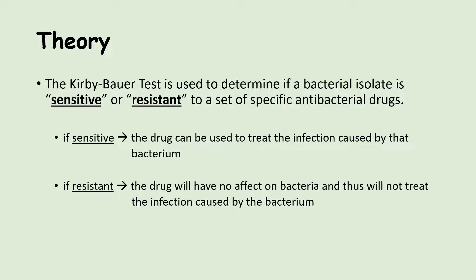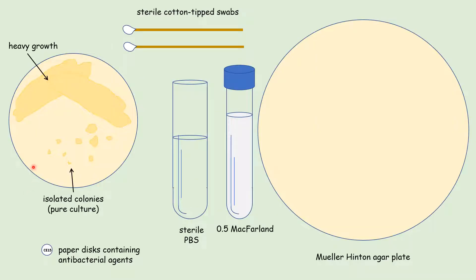Let's now look at the reagents required to perform a Kirby-Bauer test. First, we need a plate that contains the patient's bacterial isolate. This plate was streaked for isolation, so it has an area of heavy bacterial growth where we diluted the bacteria to get individual, isolated colonies. These colonies should look identical since we want to start with a pure culture. Next, we're going to need some sterile cotton tip swabs.